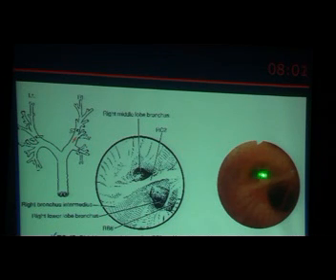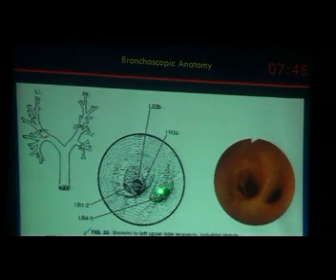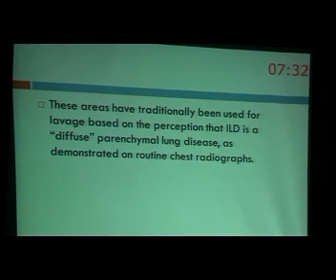يوجوالي وي do the wedging in the middle lobe either the middle lobe itself او بعدين نخش اكتر يبقى السب سيجمنت اذا كان ميديال او لاترال. بنعمل الويدجنج وبنعمل اللافاش فروم ذيس سيجمنت ودي الليفت سايد اللينجولا اللي بيشو ال بي 4 اند 5 دي اللينجولا. ده الابر لوب ايبيكو بستير وانتيريو سيجمنت وده بنخش في اللينجولا وعادة بيبقى ده الويدجنج فيها زي كده فيري ايزي والريكروتمنت فيها اعلى جدا اب تو 60%.